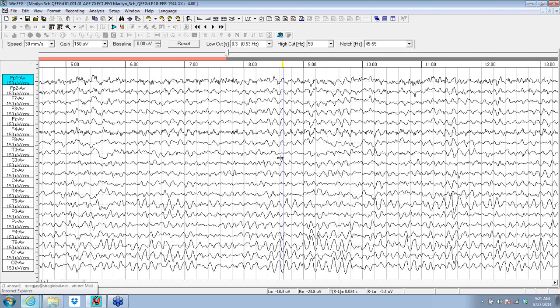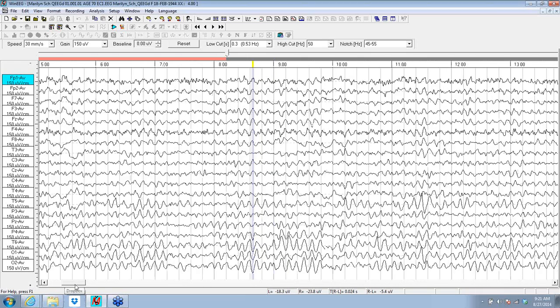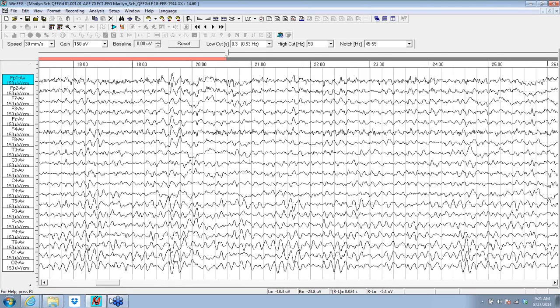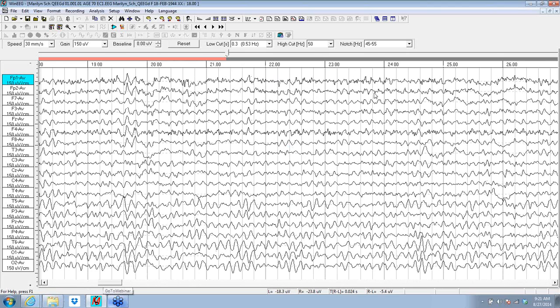Now, it's not in phase with respect to the back of the head. I mean, it's going up in the front and down in the back at this moment, so it's real. It's not like this is an artifact, like Laplacian physics is being violated somehow. But the phase in the front, as I scroll through, when I see the alpha content up front, it's very much in phase. And again, in the back, it's being stirred around. Sometimes they line up and sometimes they oppose.